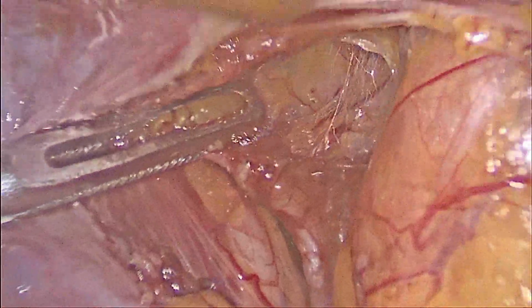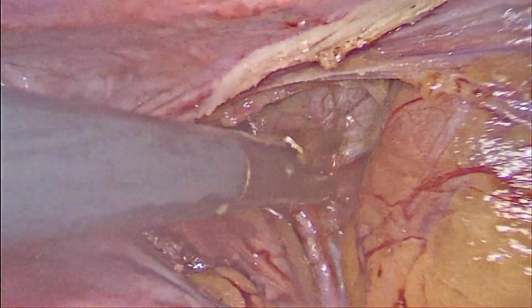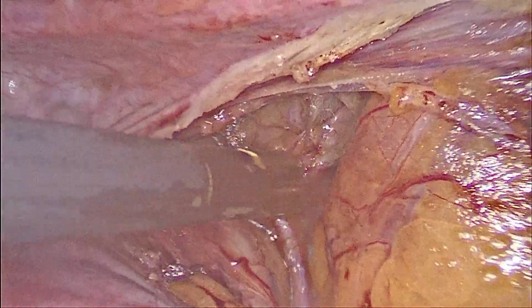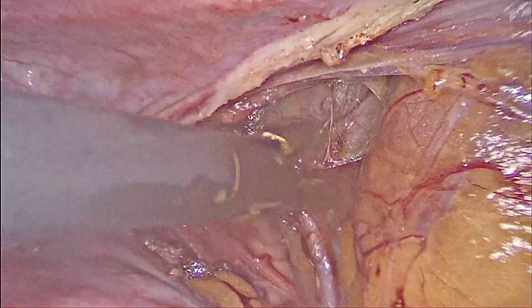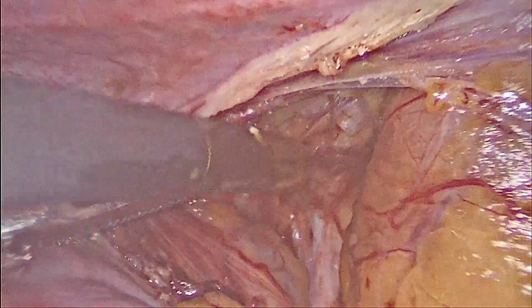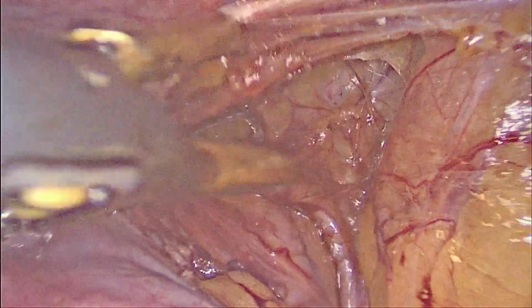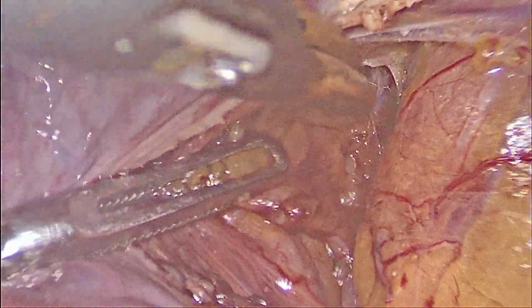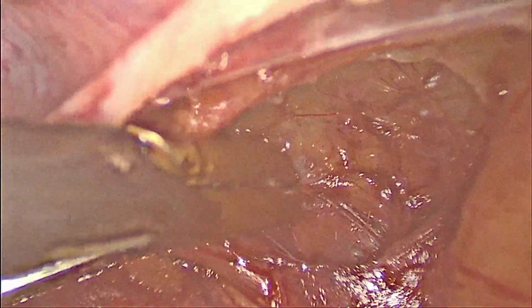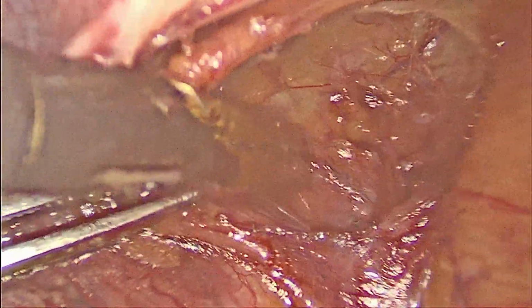So that is the uterine artery I am holding in my left hand while doing the dissection. Loose cellular tissue that is present should be dissected, and the vessel that is running anteriorly is the obliterated umbilical artery. We should be very clear with the anatomy, about which structures we are identifying, so that we ligate the uterine artery and not other vessels, which is not necessary for this case.